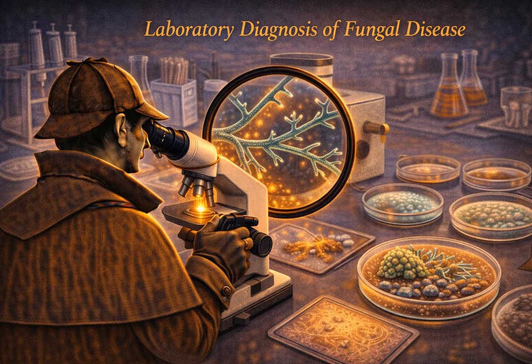And the molds. Molds are fuzzy, cottony, powdery, filamentous. They have real texture. They physically stand up off the agar plate, and they come in every color of the rainbow: green, black, white, bright yellow. That color almost always comes from the spores they produce on the surface. But looking at a fuzzball on a plate isn't enough for a medical diagnosis. We need to look closer.